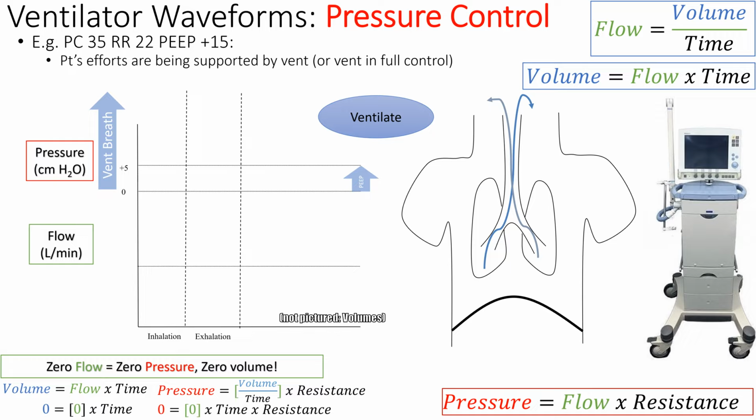Okay, so then pressure control ventilation. So what happens in pressure control is we're setting what? Setting the pressure you want to go. You want anything higher than 30 or 40 or 20, right? It's up to us to figure out which one it is. Some patients, they like it better and they want 20, but usually this is used for the sicker patients when it is 35, 40, 45.